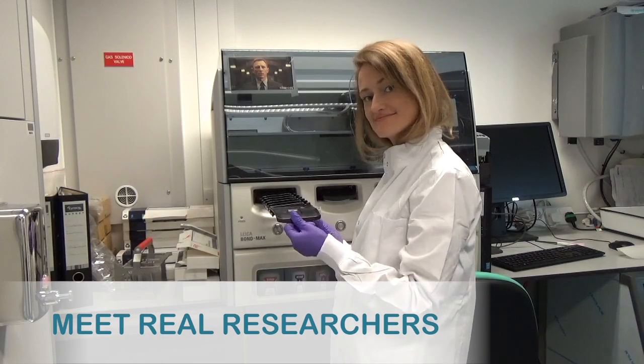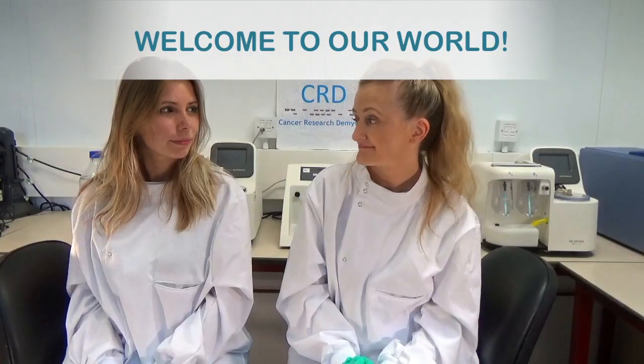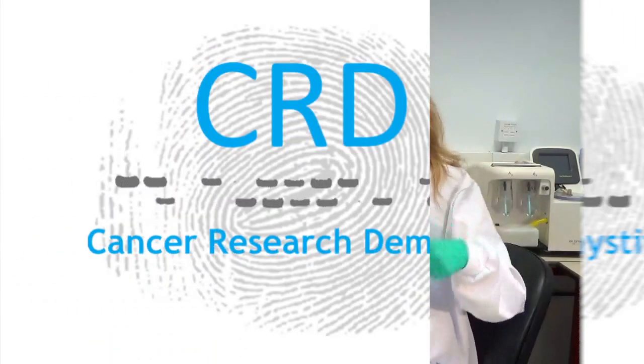MRI prostate moulds - what are they and how do we use them in research? Hi, I'm Susan, this is Hayley, and welcome back to Cancer Research Demystified. So as you just saw, we're going to be talking about MRI prostate moulds.